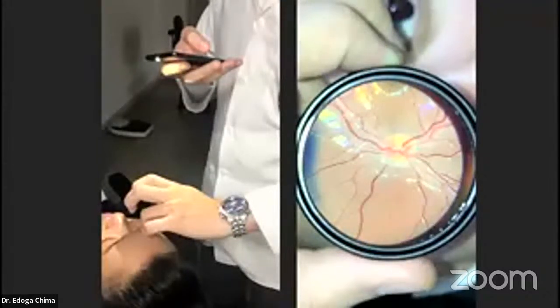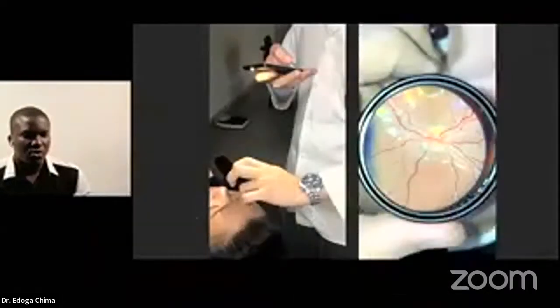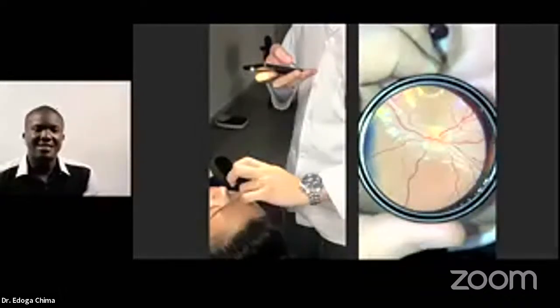The lens eye distance, which is the distance between the eye and the phone, and then the lens phone distance, which is the distance between the lens and the phone. So when you want to take this image, you are dealing with two different distances.